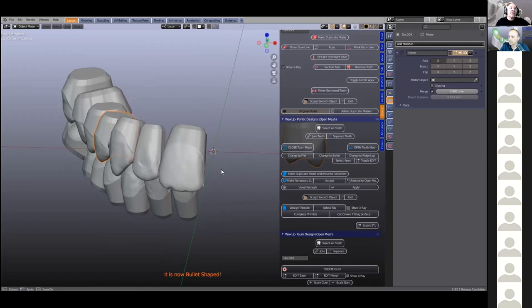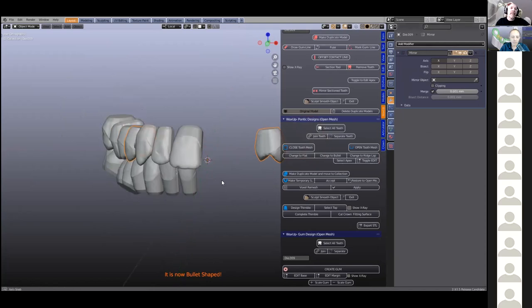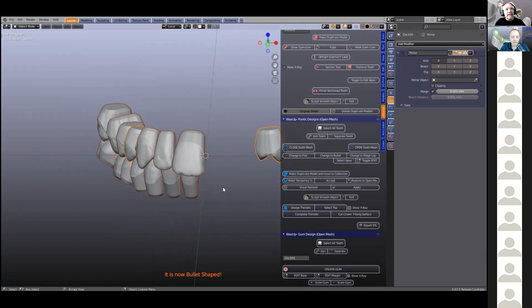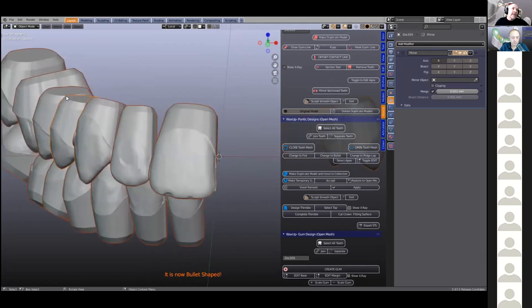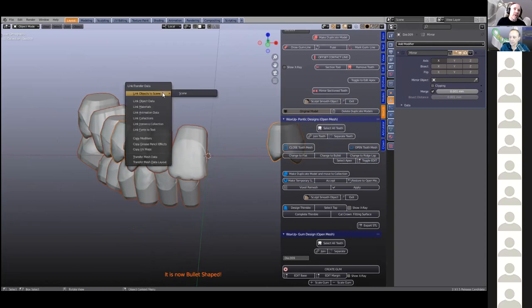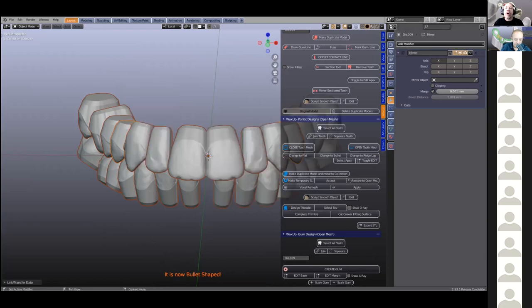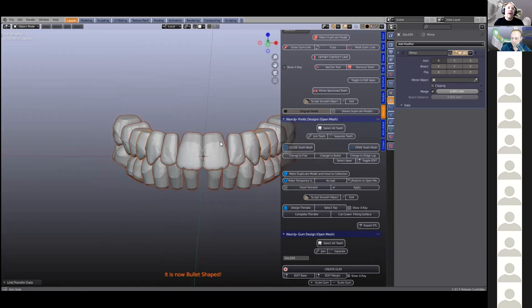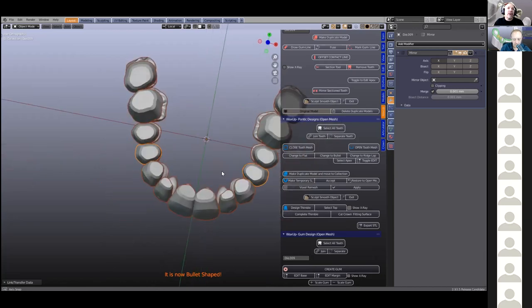Notice now that whichever one I click, that little orange dot is in the center, which means we can now mirror image these teeth. I'm going to open up the modifier and go to mirror. Notice that the one I've selected has mirrored; the others haven't mirrored yet. I don't want to go through each and every one and do a modifier — that's a waste of time. I'm going to click A to select all my teeth. One of them is orange — that's important. I'm going to go control L on the keyboard. Control L means we can link materials, colors, data of animation, or other things. Then we're going to go copy modifiers, and that will copy them all in one go. Now we've got an arch which has been mirror imaged.